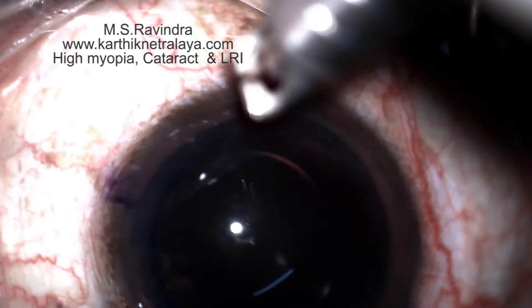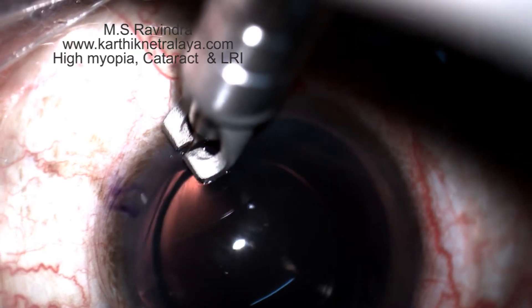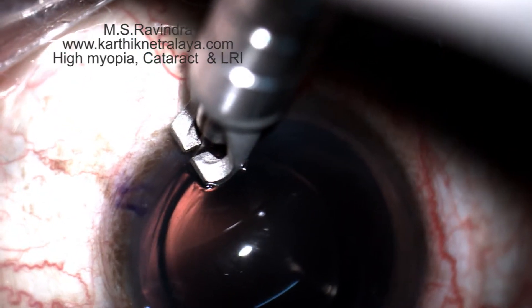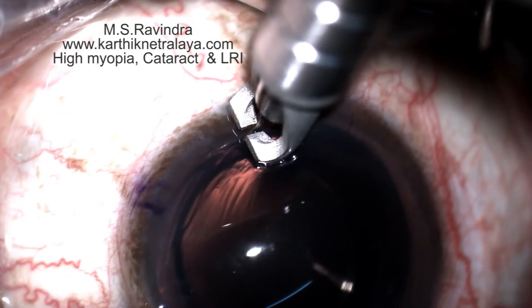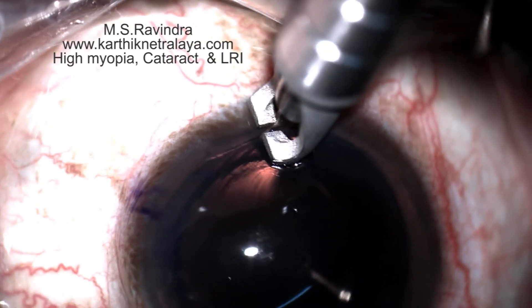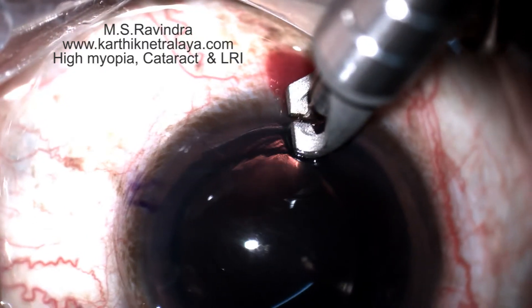The diamond knife is placed about a millimeter inside the limbus. The blade is parked on the cornea so that it enters deep, then dragged along an arc to cover two clock hours.